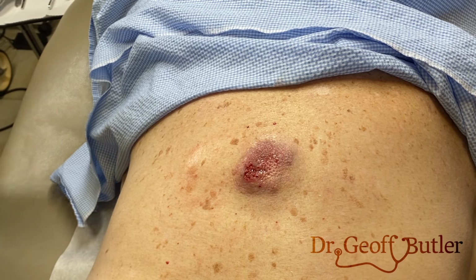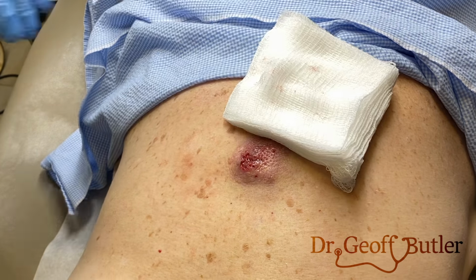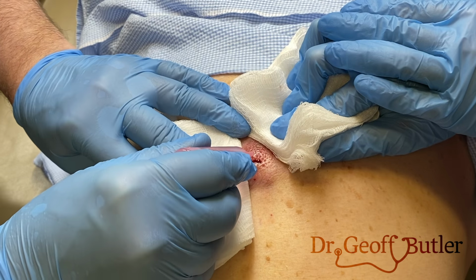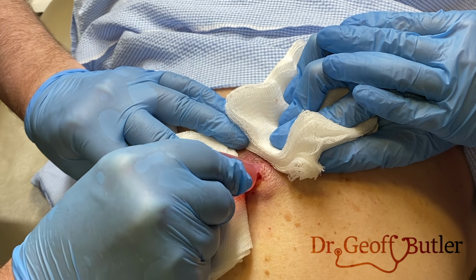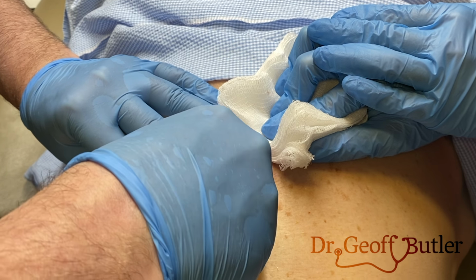So this I want to do once I syringe it. Just hold that there for me. So this one, this is sterile saline. We just want to be irrigating this. This you want to be moving around a little because you want to infuse the old cavity. You okay? Mm-hmm.